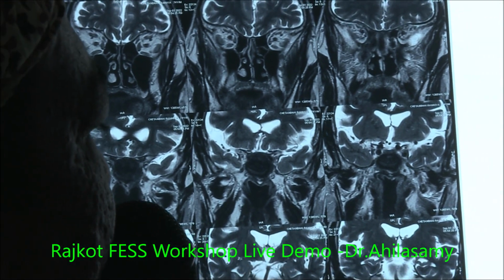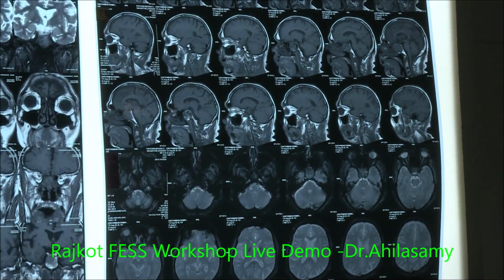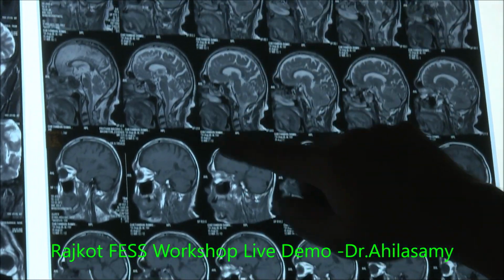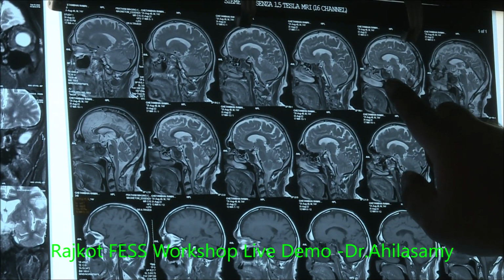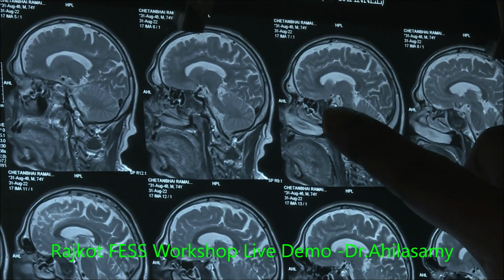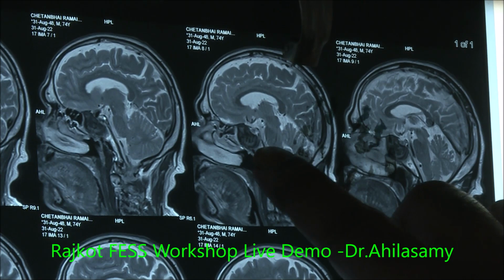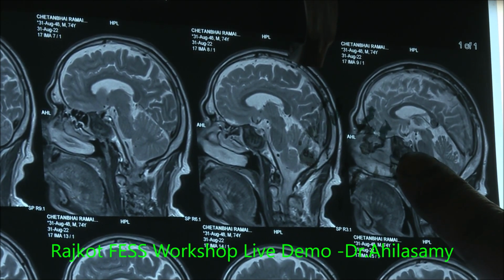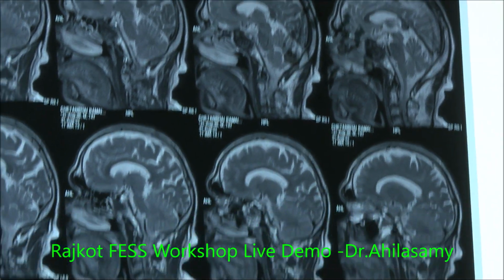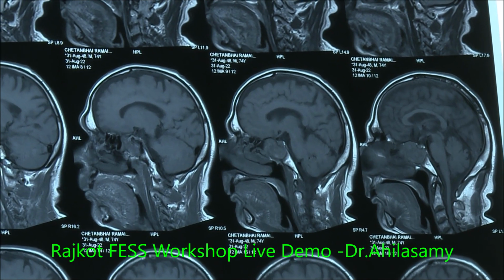Can you show us the sagittal section? Can you zoom this? This is a sagittal picture. This is the sella. This is the sphenoid. This is again a T2 image. T2 also it is hypointense, so it is showing that it could be a fungal ball. And then this is the T1 image. You can see the mass. It can even be a tumor also.